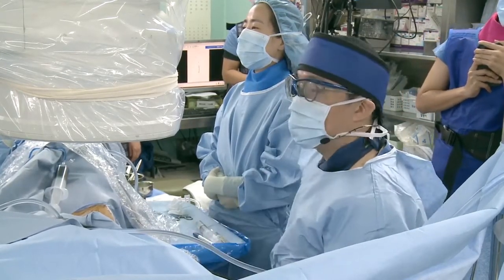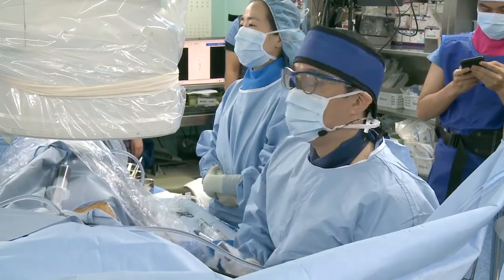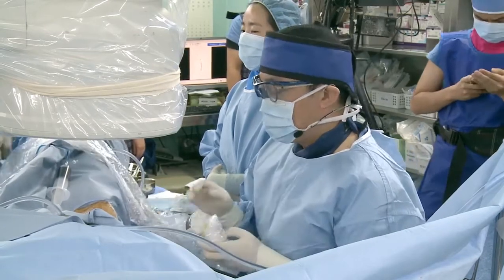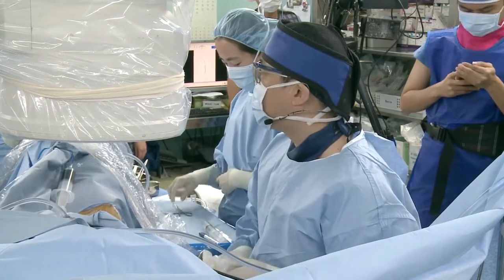So I'm sitting just next to my patient, on the right side, and I've prepared to check the ultrasonography for performing the percutaneous puncture.